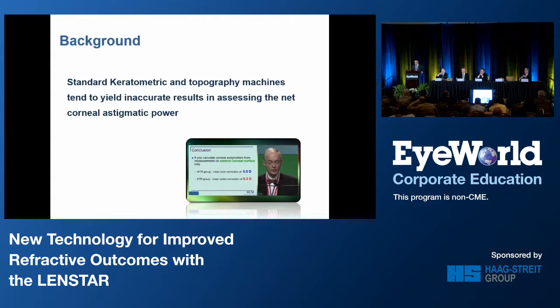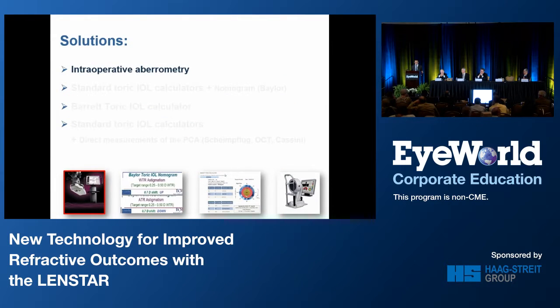Today we know that standard keratometry and topography machines tend to yield inaccurate results in assessing the net corneal astigmatic power. It has been 4 years since Doug Koch reminded us of the role of the posterior cornea in toric IOL calculation, and the next obvious step was to figure out how we should implement this knowledge in our daily practice.